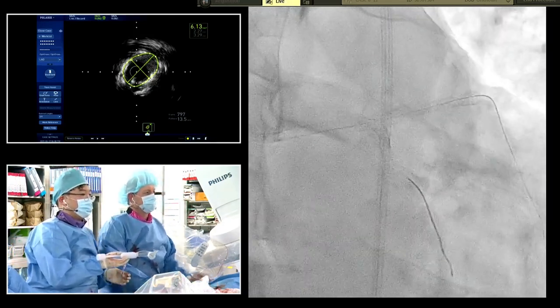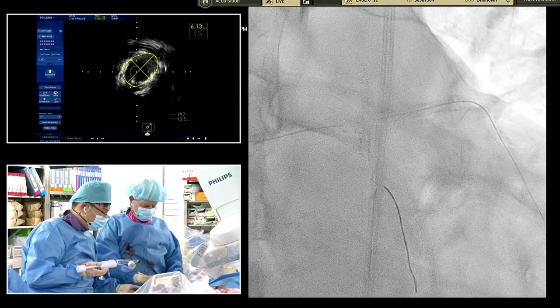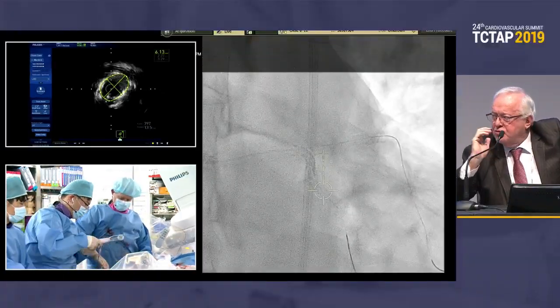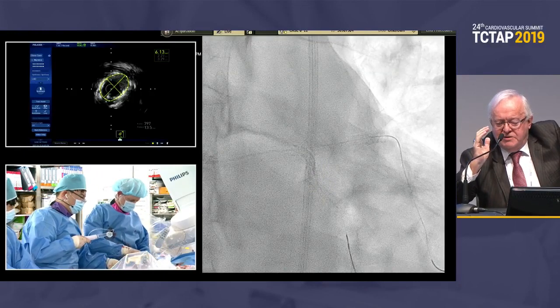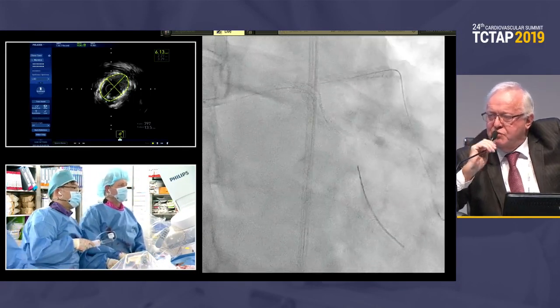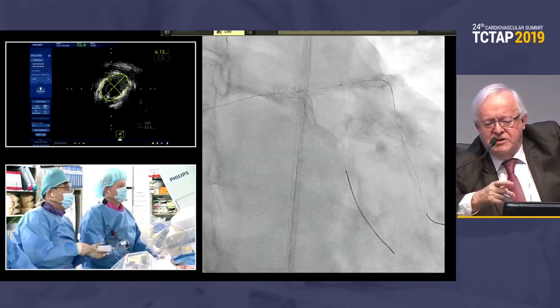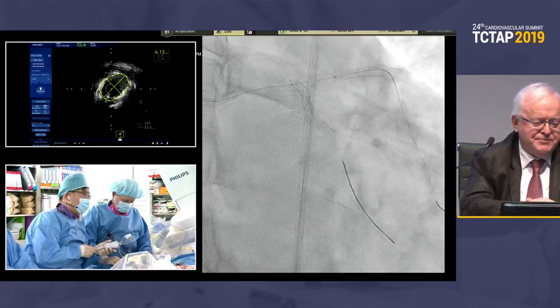We don't know the clinical consequences of non-respect of three diameters anatomy. But from simulation, we know very well that when you increase the two distal segments, you're increasing the vascular surface, and doing that, you are creating zones of low wall shear stress, which is a promoter of neo-intimal hyperplasia, neo-atheroma, and so on. So I think, I've not seen at the beginning the three diameters. I've seen two, one big tube and small tube. Well, it depends.